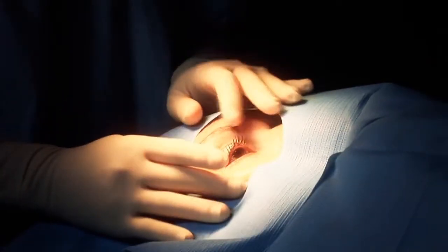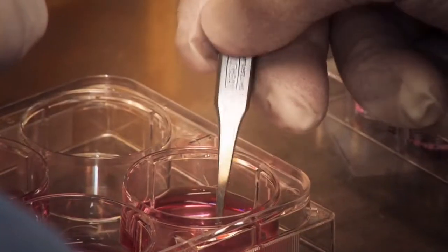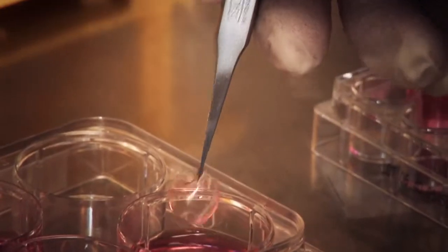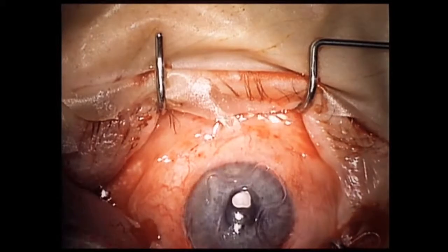This patient's eyesight will be restored. Stem cells from the patient's own eye have been harvested on this simple contact lens. This will be placed on the eye to overcome the damage caused by blinding corneal disease.